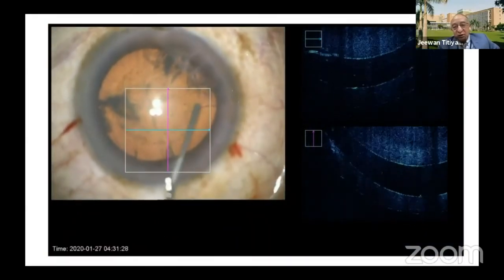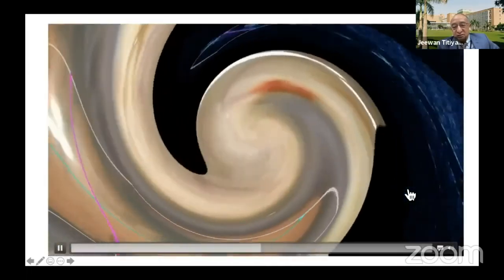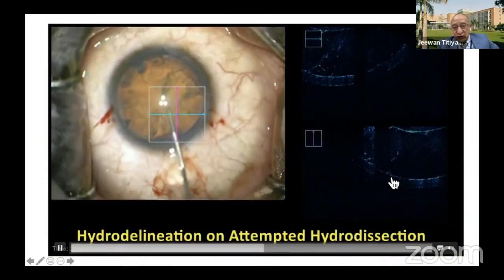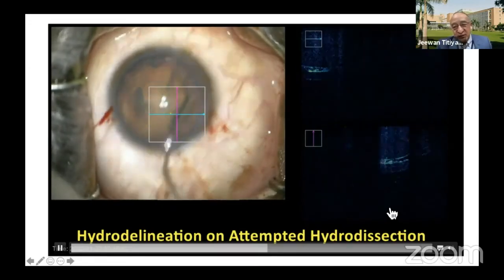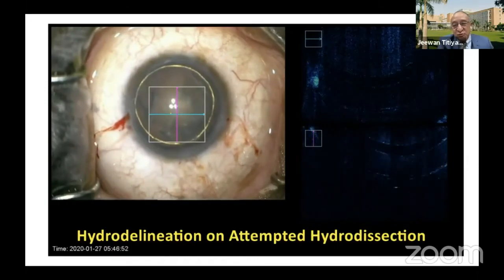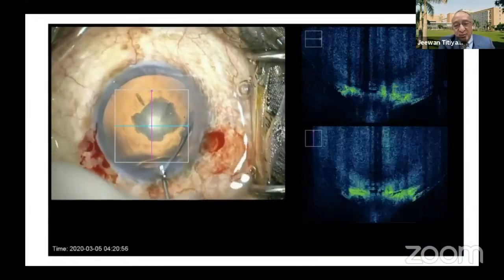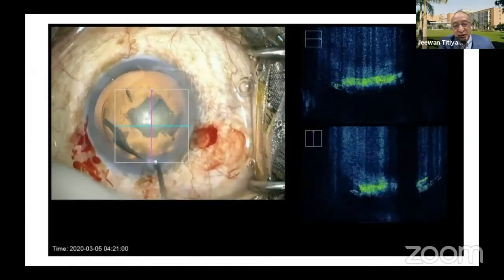Here, we already have a hydrodelineation. Decompression decreases the volume of the fluid. And subsequently, when you do a hydrodissection again, you see the fluid is filling in both the areas, the delineated as well as the dissected area. So in cases where your posterior capsule is weak, this can be titrated also. An immediate decompression will help in these cases. This is again a posterior polar cataract. We are doing a delineation first.